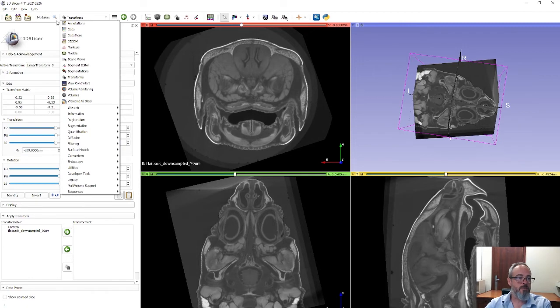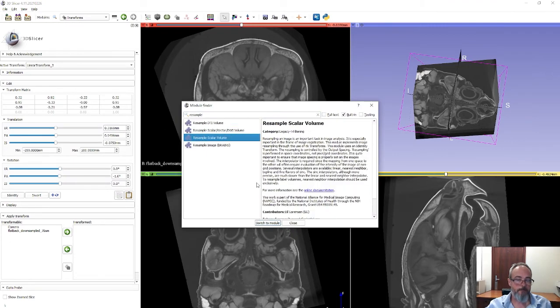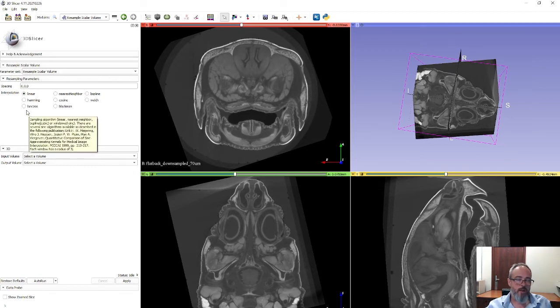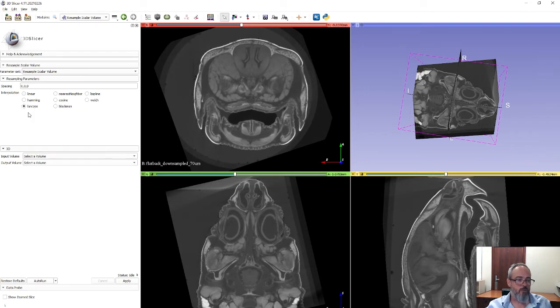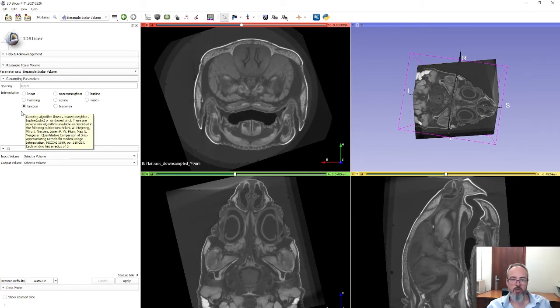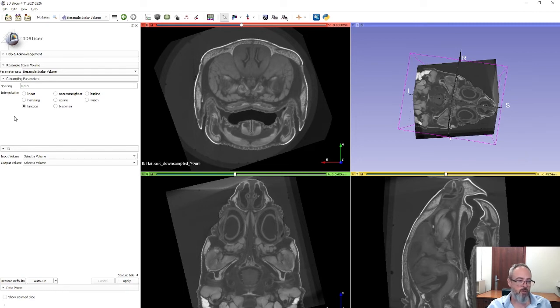The Resample Scalar Volume module isn't in my list so let's search for it and switch to the module. We want to choose an appropriate interpolation method — in this case I'm going to choose Lanczos, which does a pretty good job for 3D data in general. Just be aware that this is changing your data: you are doing an interpolation and so the grayscale values of each voxel are going to get mapped from their original position to a new position on the grid. Be aware that this may be important for the particular project you're working on.